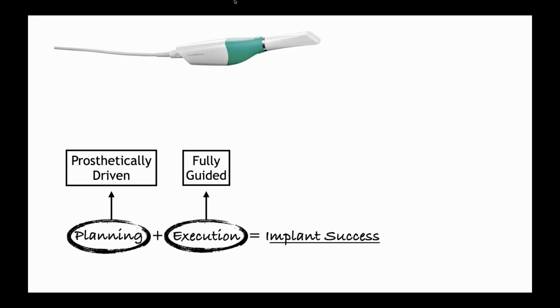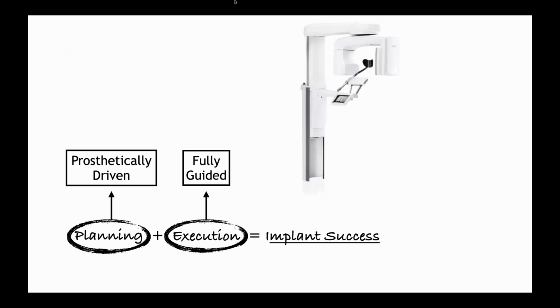We need an intraoral scan or a digital model inside the mouth of the hard tissues and the ridge, right? So when we're planning implants, we for sure, most critically, need a 3-dimensional CBCT of the patient. And those are the essential components for the planning process.